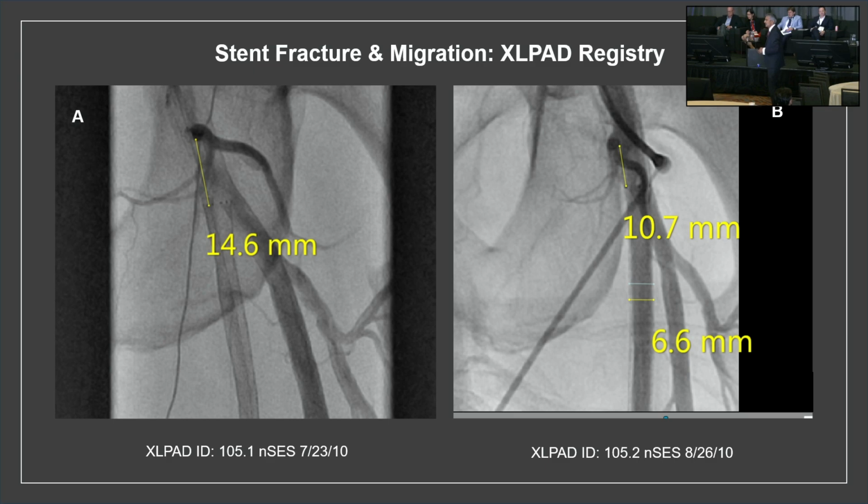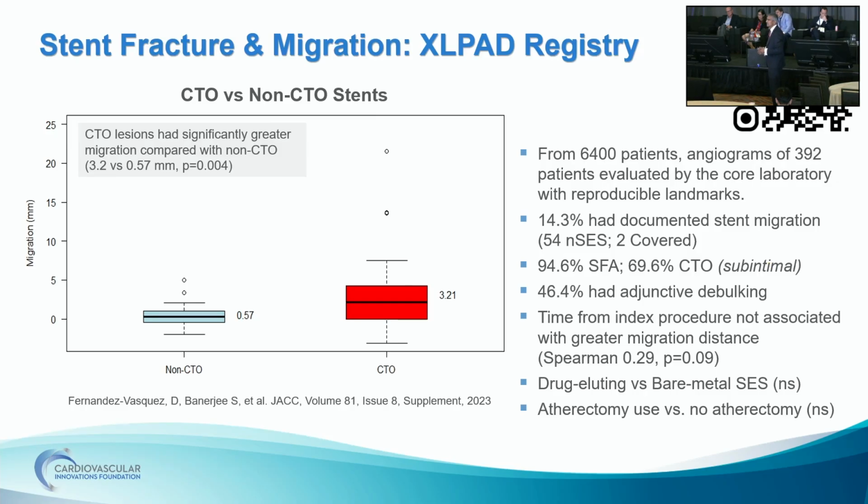Look at this stent fracture and stent migration. This stent was definitely below or just at the level of the profunda. Now it has moved around 4 millimeters above and closer to that branch and completely covers the profunda. So all of these things that we are talking about, stents in the common femoral, in the ostium, I think these things need to be relooked and re-imaged and reassessed in the spectrum of things.